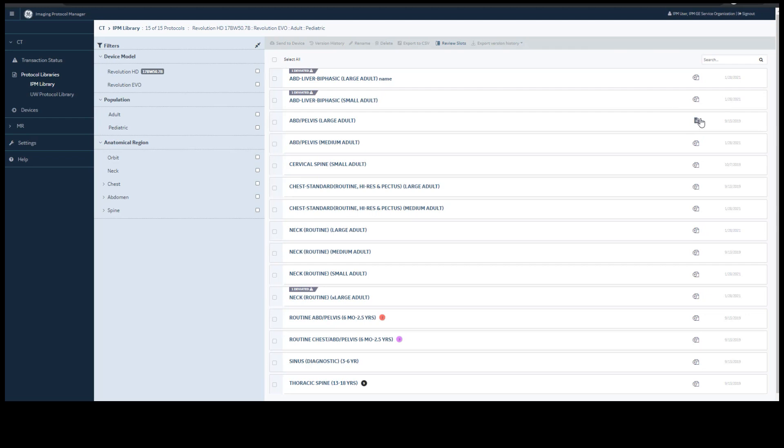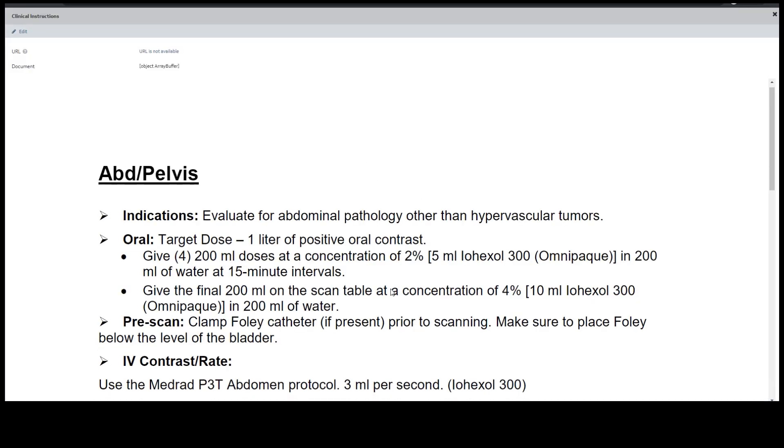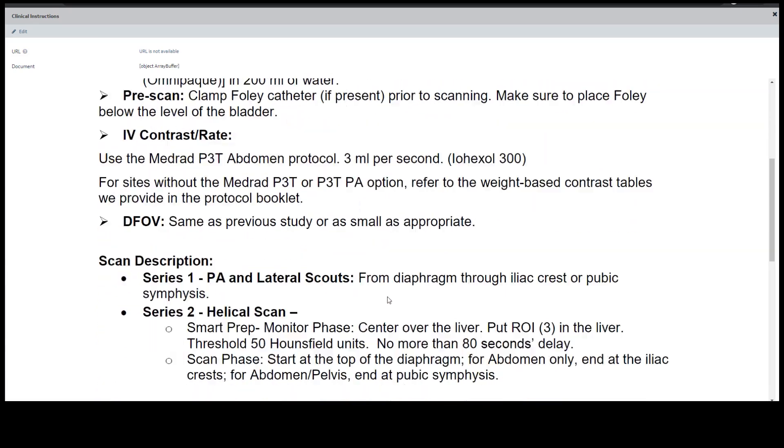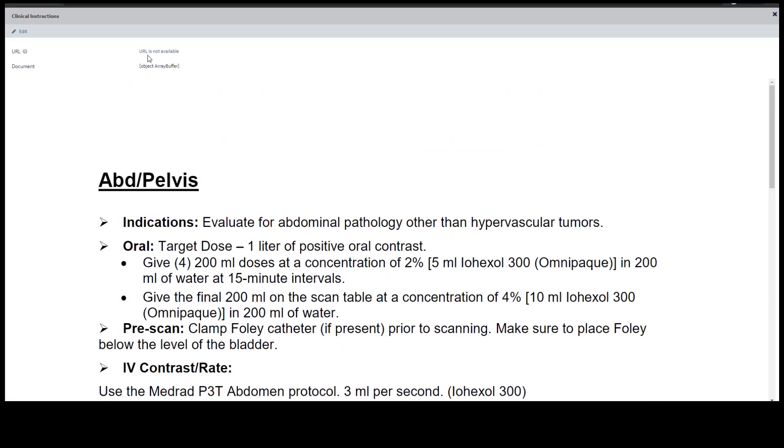Inside your standard library, you can add clinical instructions. You can see an addition here denoted by the paper icon. You can click on that and you are able to look at the PDF that was attached and you are also allowed to attach your URL.